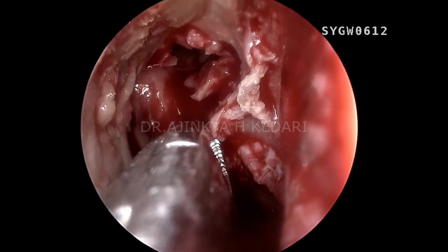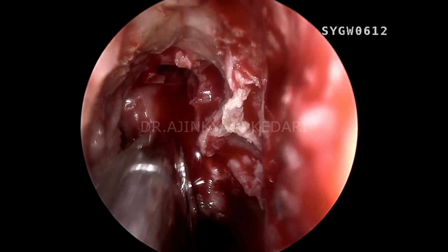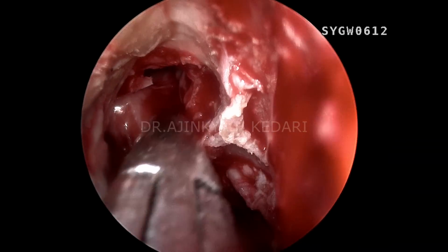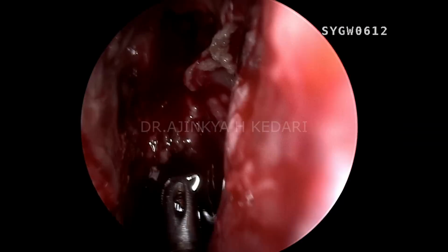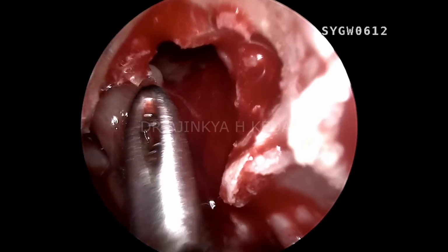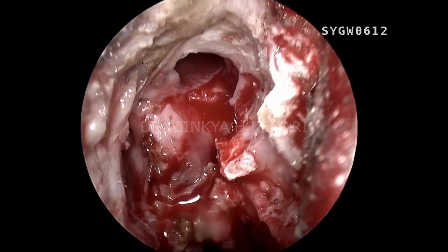And what I can see, once I remove that, I'll be able to see the entire superior half of the patient's frontal sinus. So I'm using a straight Blakesley, trying to remove all that bony segment. Give it a thorough wash, remove all the blood clots to have a good visualization inside. You can see that is the superior half of the frontal sinus.